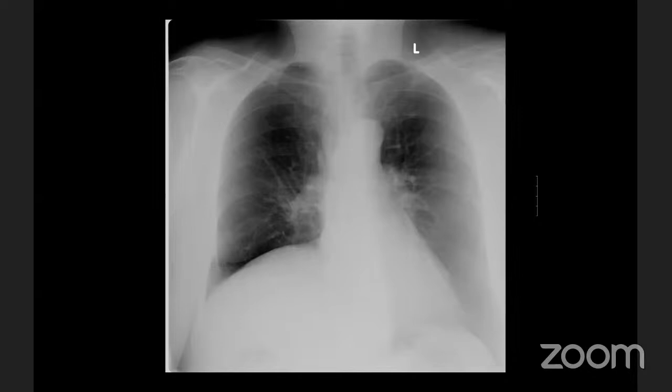Hello, yes, I have a question. Namely, what are those nodular-looking lucencies in the right lung field? You mean further cranial? Yeah, those. Is it normal or pathological? Linear, like this stuff, or this stuff? The lucencies, like this, the dark thing here. Yeah.